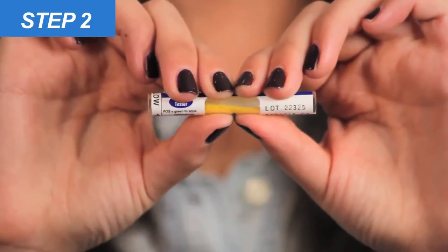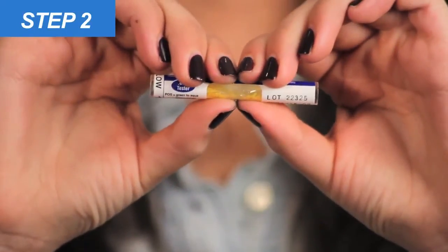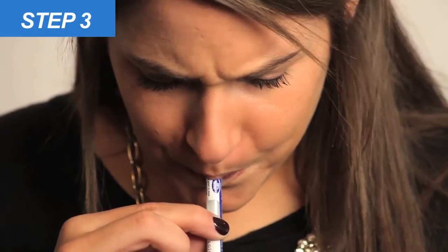Step two: squeeze the middle of the detector between your thumb and forefingers to break the inner glass tube. Be sure not to crush or bend the detector.